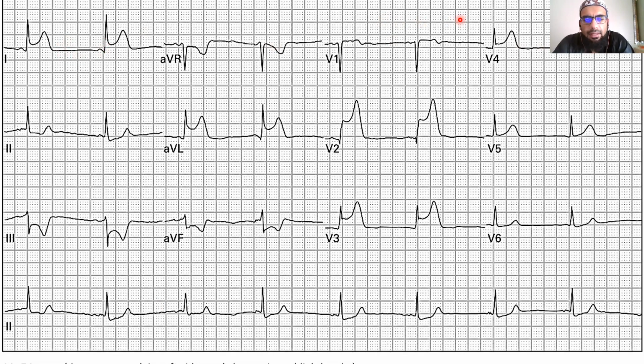The other reason that you get PR intervals that look like that is what we call junctional rhythms. And junctional rhythms most commonly have an absent P wave or a very shallow P wave. Junction means that between the atrium and the ventricle, you have an alternate pacemaker cell.